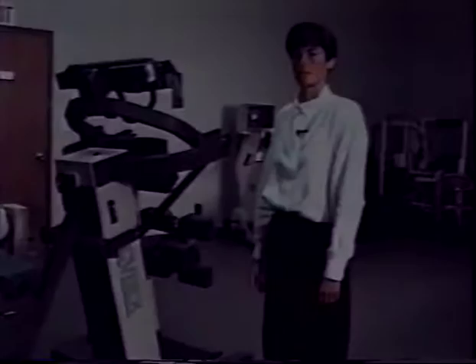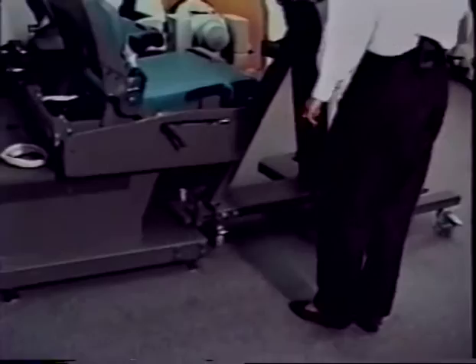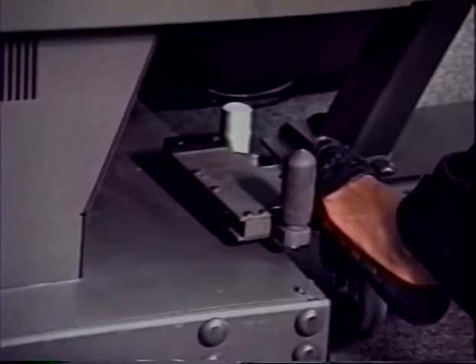To dock the TEF modular component, roll the component up to the 6000 unit so that the docking hitch is parallel to the docking post. Place your foot on the back of the docking hitch and push the hitch so that it clamps to the post.